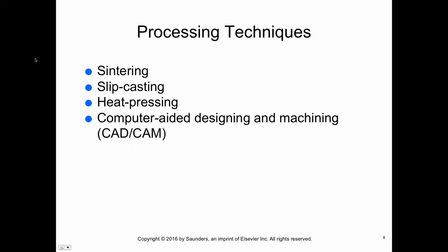So porcelain can then be added by layering it onto the core to complete the color and contour, and surface stains can then be added. Various processed ceramic materials are available in blocks for use with the CAD/CAM technology. A digital impression of the tooth is taken, and software is then used to design the restoration to establish the contours, proximal and occlusal contacts, and the margins. A block of ceramic material is selected and placed into a milling machine. A computer instructs the milling device to cut the restoration.